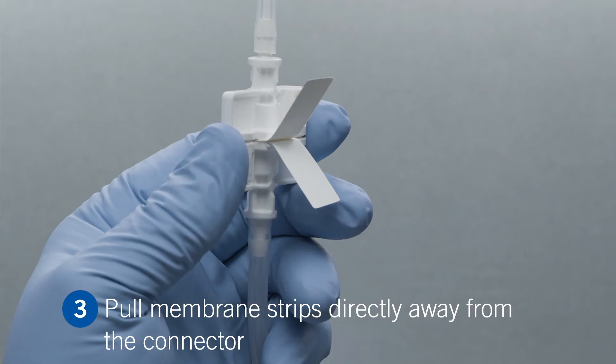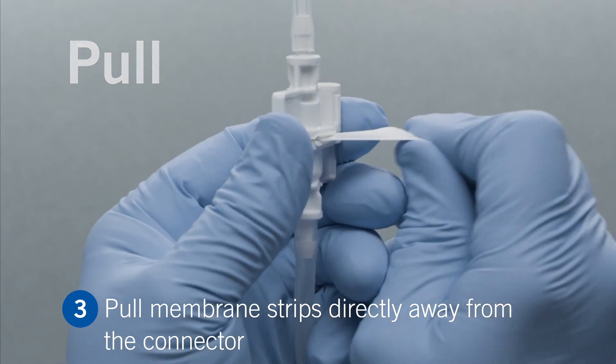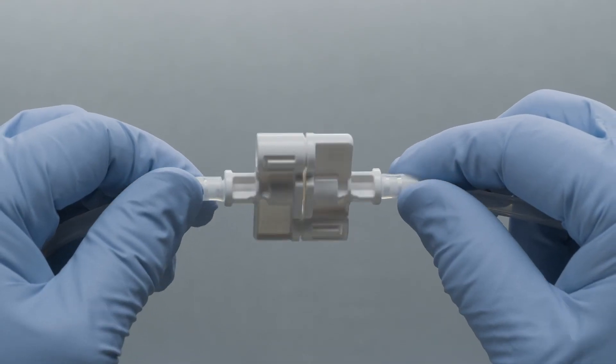To complete the assembly, pull the two membrane strips simultaneously by pulling the strips away from the connector. You are now ready for sterile fluid transfer.